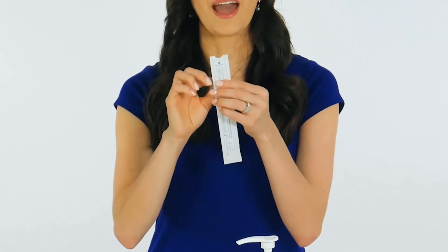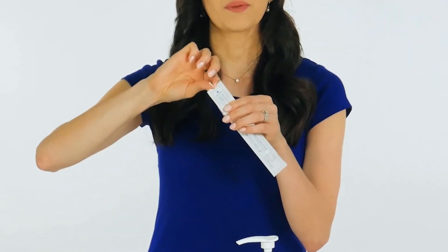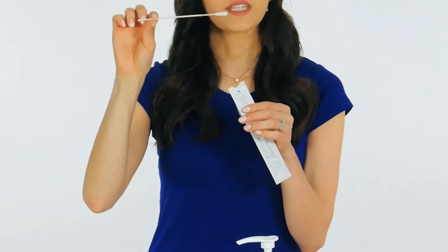Partially peel open the swab package and remove the swab. Do not touch the soft tip or lay the swab down. If the soft tip is touched, the swab is laid down, or the swab is dropped, request a new swab specimen collection kit.